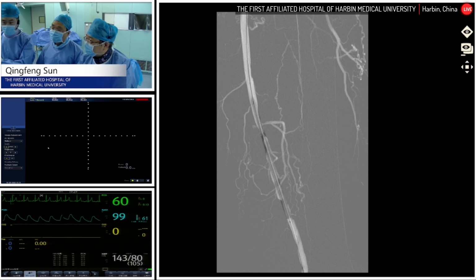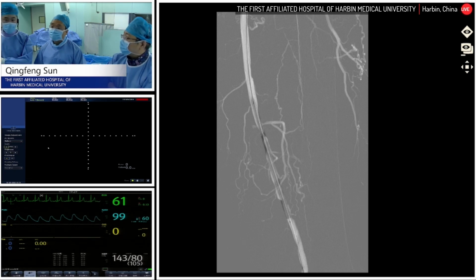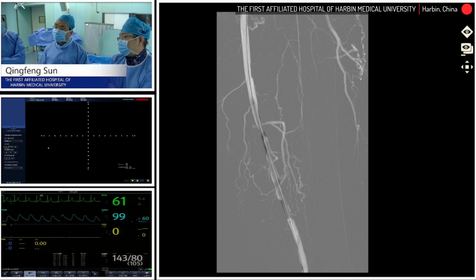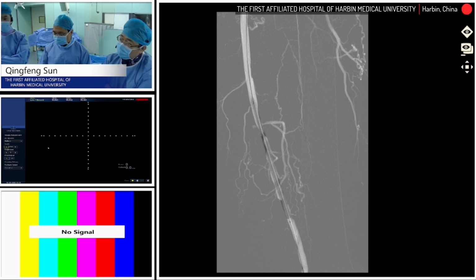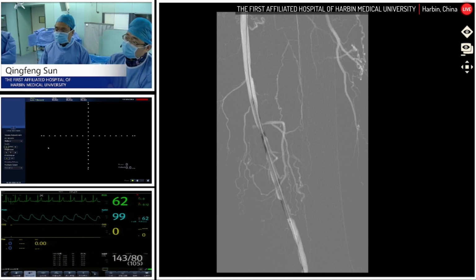Some cases like this, they don't have IVUS. So how do they decide what's the character of the disease? What's your opinion? It's difficult to see, but it's a good question. I think maybe we use the medical history, and the most is the Doppler.